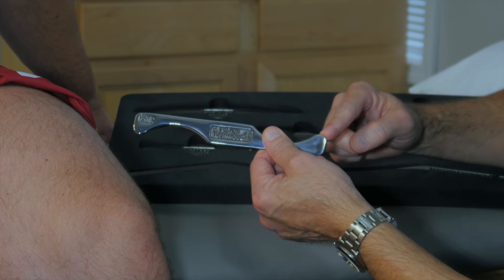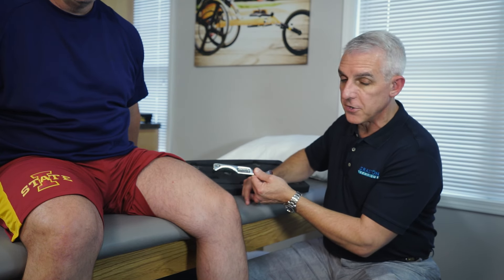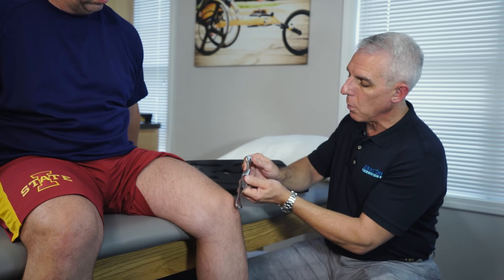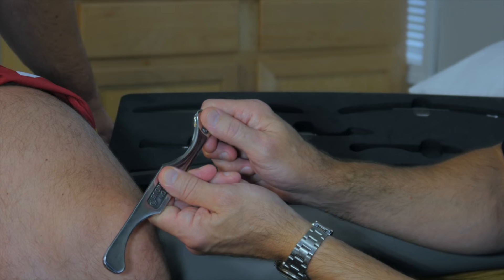These are appropriate for treating smaller, specific areas. The instrument can be held with either two hands or one hand. For a two-handed grip, we'll pinch the instrument on either side of the treatment edge, between the finger and thumb.